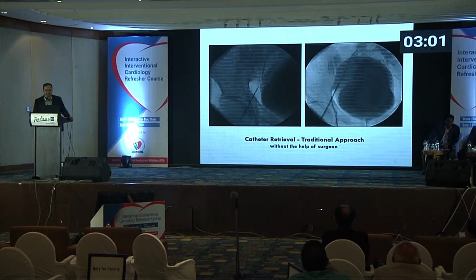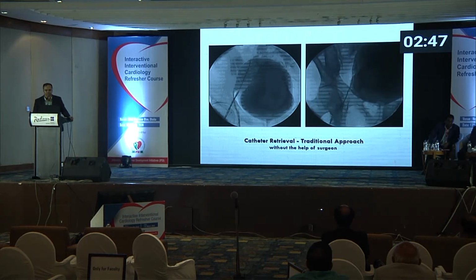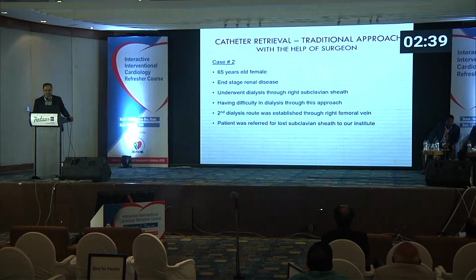It was pulled back within the sheath and the broken catheter was successfully retrieved from the vascular system. Retrieval in progress, and the full part of the broken catheter was taken outside through the sheath.